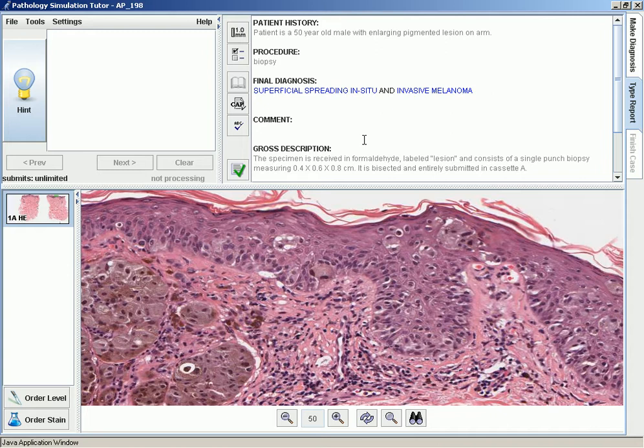As you type, the system tries to extract useful information from your report. The text you type will turn different colors. These colors have important meanings. So let me type a couple of things to demonstrate that for you.